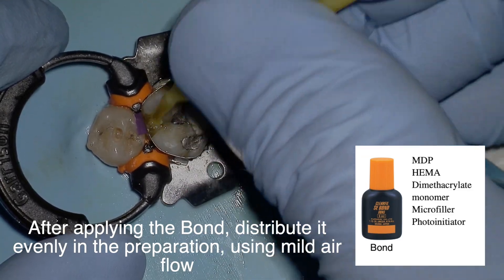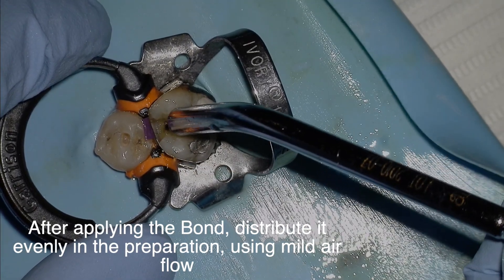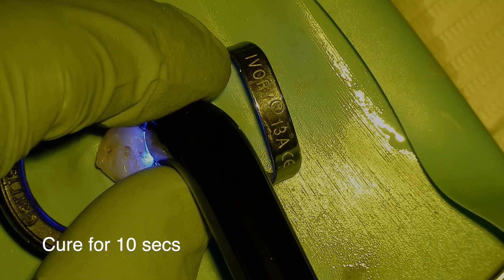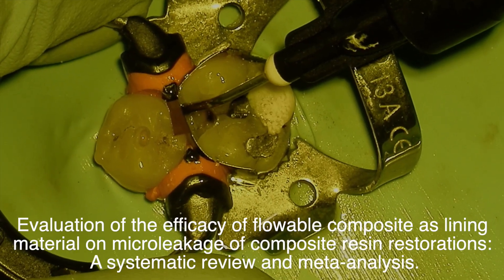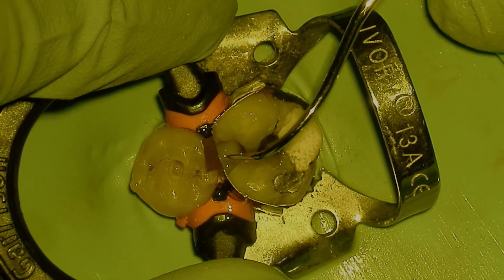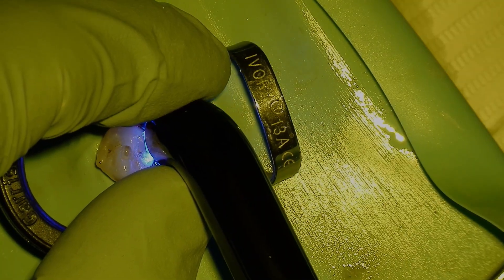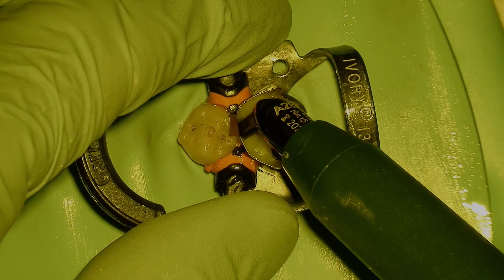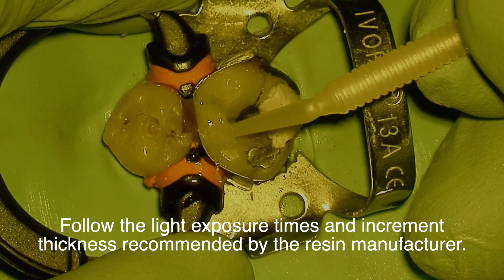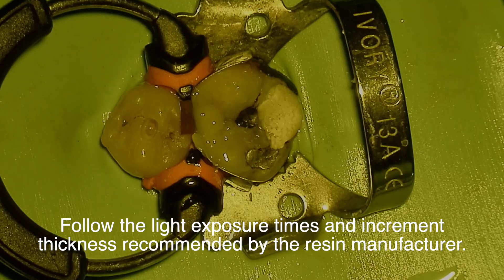Following primer application, evenly distribute the bonding agent everywhere, making sure there are no puddles or pools, which decrease bond strength. Then cure it. We're restoring this Class II restoration using a flowable composite, moving it into the corners with an explorer. Based on current literature, there is very limited difference between flowable, packable, or any composite type — what's critical is following the light exposure times and increment thickness recommended by the manufacturer.